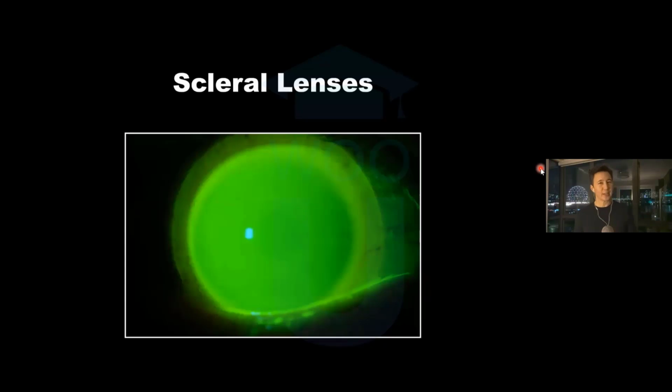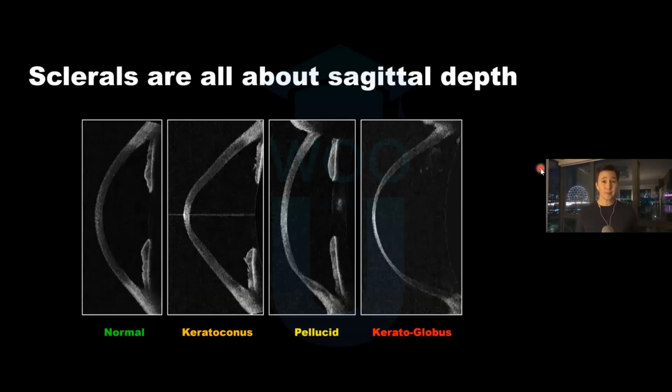Let's talk just for a second about wave lenses building a scleral lens. And I understand from the wave team, the vast majority of wave lenses are Ortho-K. Makes sense. It's kind of a dominant contact lens today. It's certainly at academic conferences, the vast majority are very much myopia control related and Ortho-K related. But sclerals, of course, is that other hot topic in specialty contact lenses. With the wave system, you can build a scleral lens.